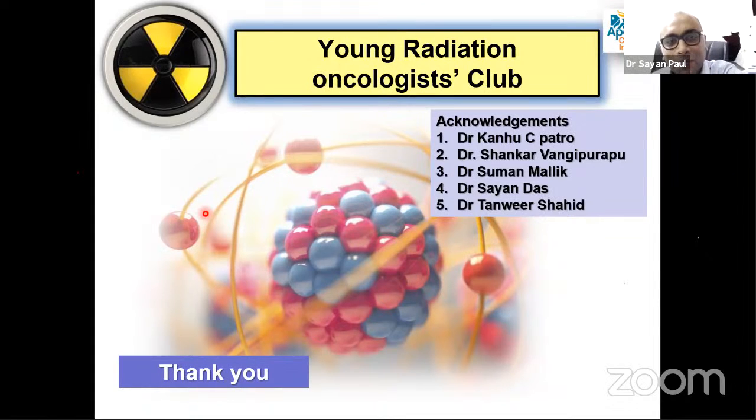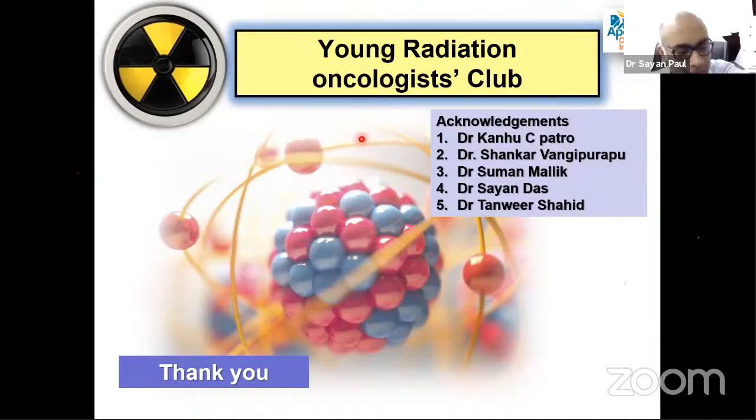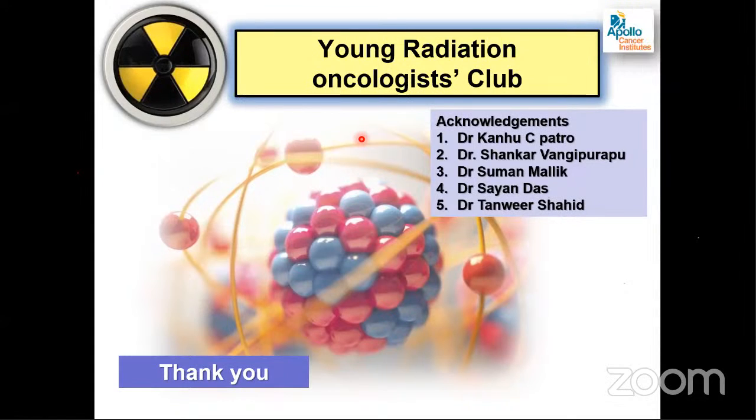Is there any indication for using KV-MV combo in imaging? I didn't get the question. Why would you do that? If you have a KV cone beam CT, you will do a KV cone beam CT. Why would you do an MVCT? Because you unnecessarily give more imaging dose. Your image is also not good.